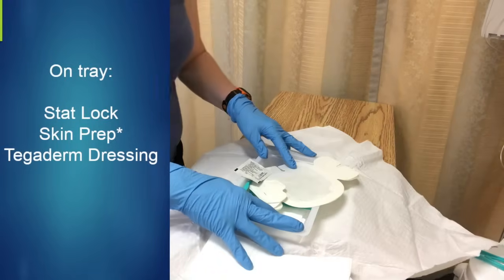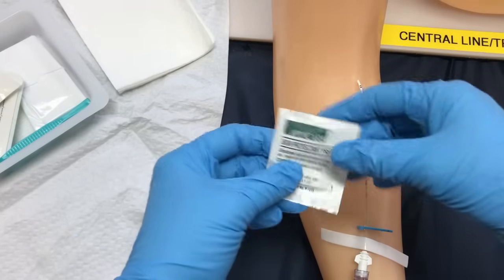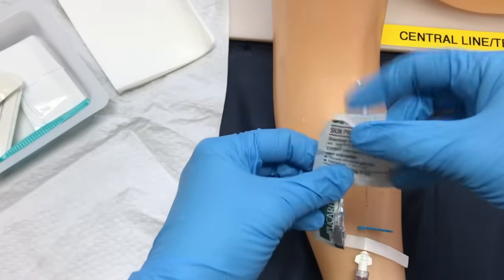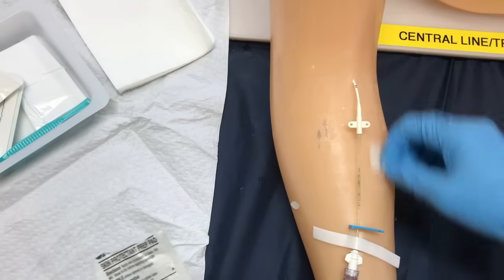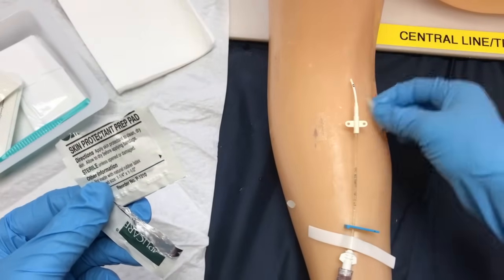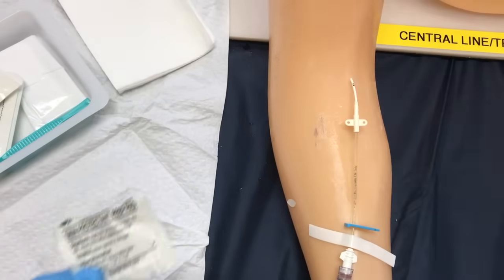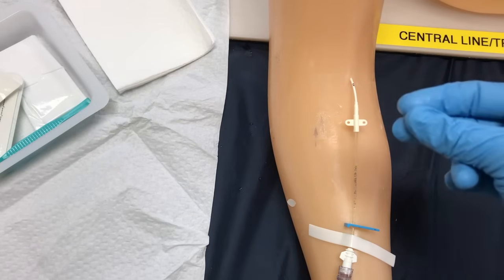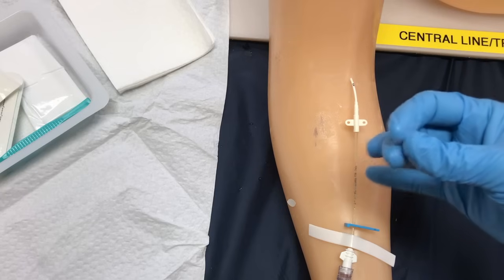I'm going to bring my sterile tray over now. So I've brought my sterile field over so you can see more closely. At this point in time we want to put our skin prep on — everything is dry now, so we're going to put skin prep around the entire area. Remember this is sterile; it came in my sterile kit. This is going to get tacky, and you'll know it's ready because my gloves are starting to stick together — the tackiness is there.